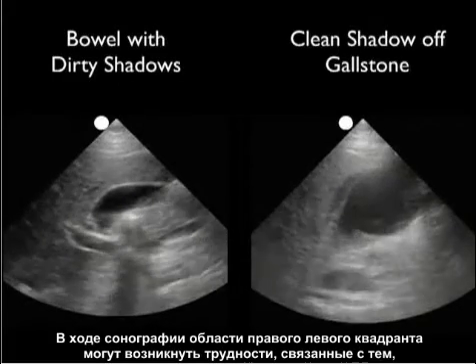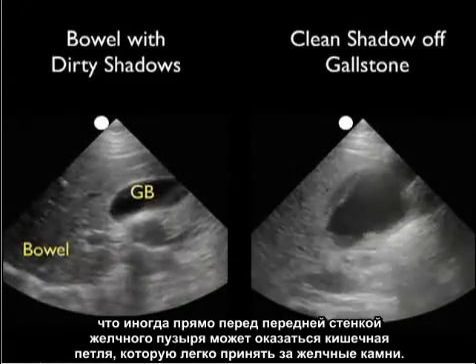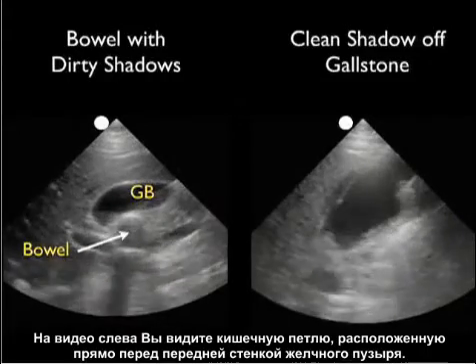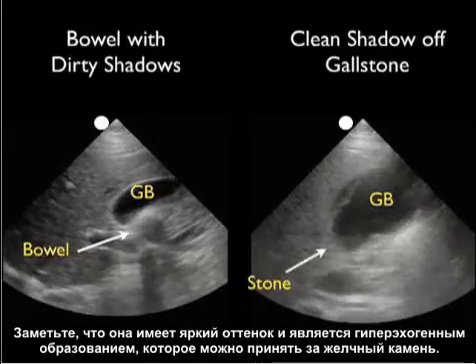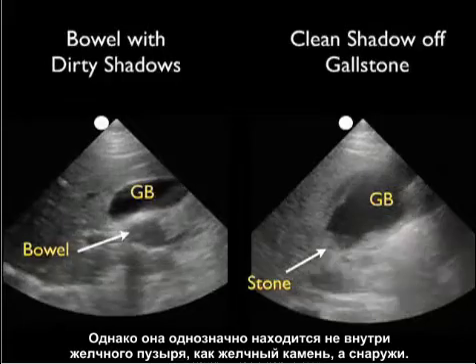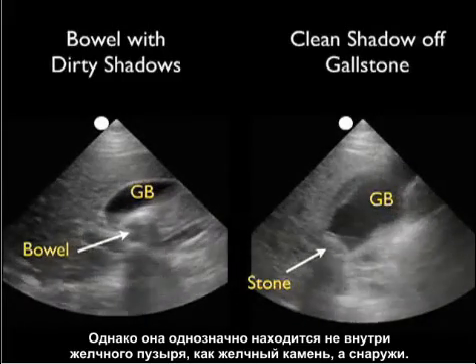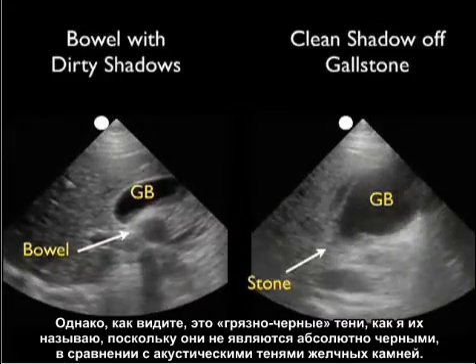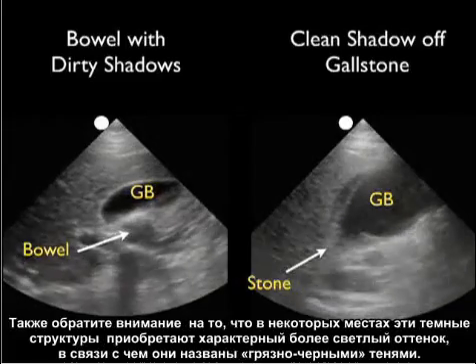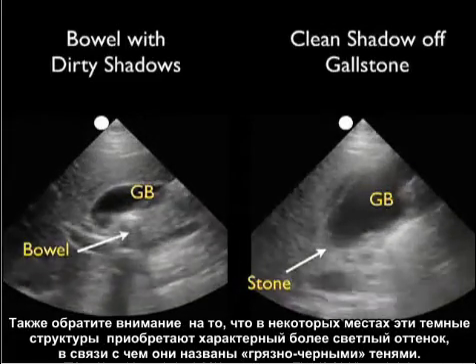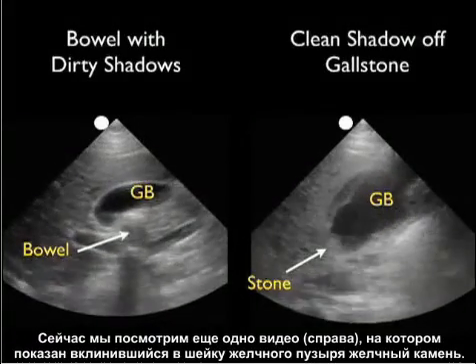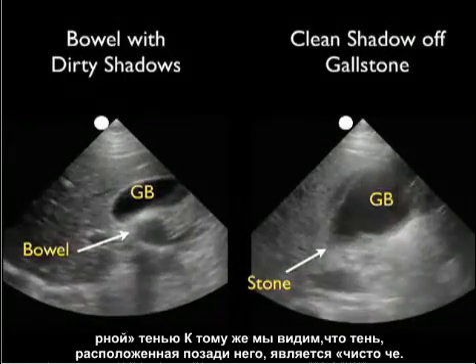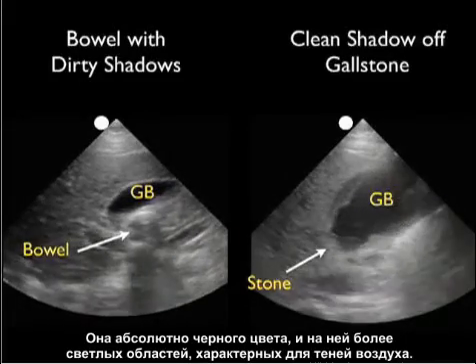One potential pitfall in right upper quadrant sonography is that a loop of bowel may come right up against the wall of the gallbladder and be mistaken for a gallstone. In the video clip to the left, we see a loop of bowel against the posterior wall of the gallbladder — it has a bright hyperechoic appearance that could be mistaken for a gallstone. However, the loop of bowel is clearly outside the gallbladder wall. Also, the shadows off the air-filled bowel are dirty shadows, not completely dark, with areas of white within them. In the video clip to the right, an impacted gallstone at the neck has a hyperechoic appearance, is clearly within the lumen, and the shadow off the back is a clean shadow — completely dark, without those light areas that characterize air shadows.